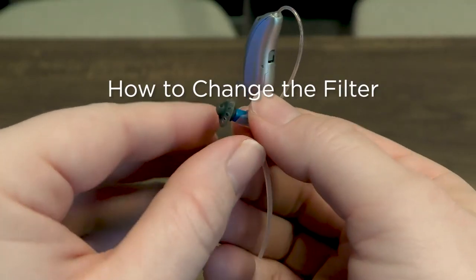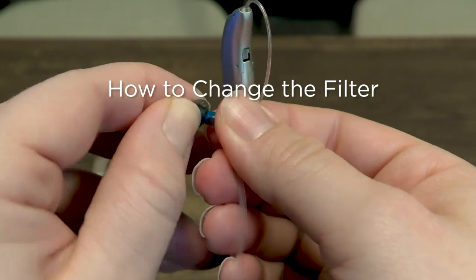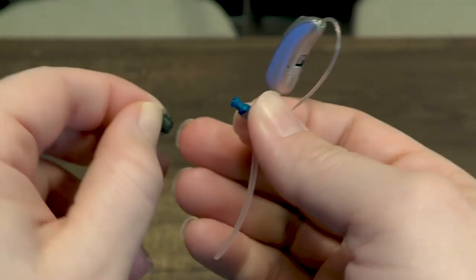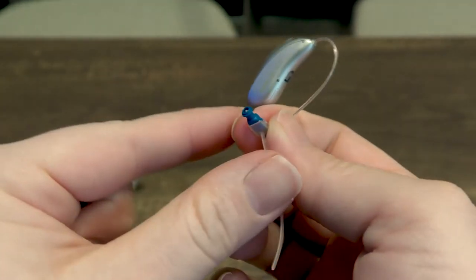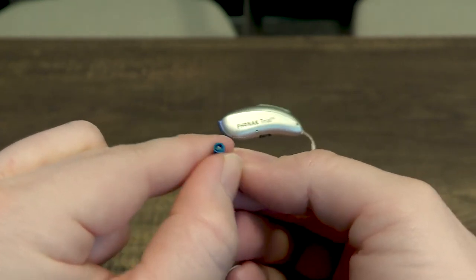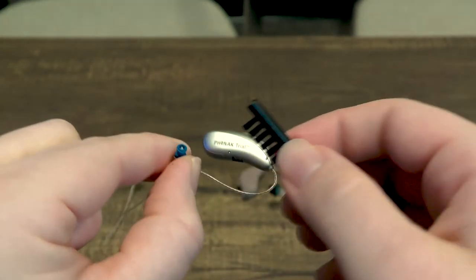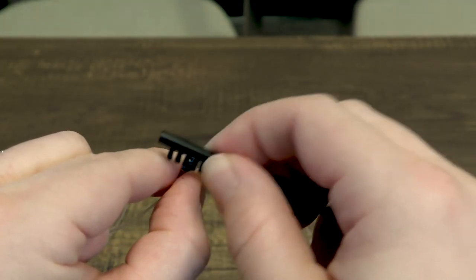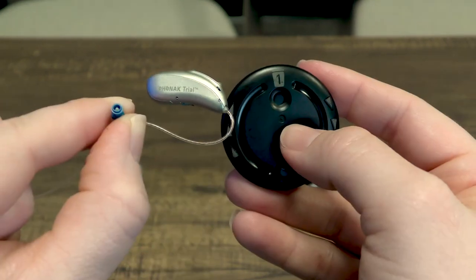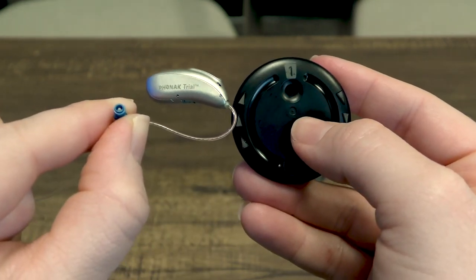Now we're going to show you how to change the filter on the Phonak Marvel hearing aid. You want to remove the dome from the hearing aid. Brush that wax out of the filter. See if you can get any wax out, if there's any visible wax. If not, you can change the wax filter.